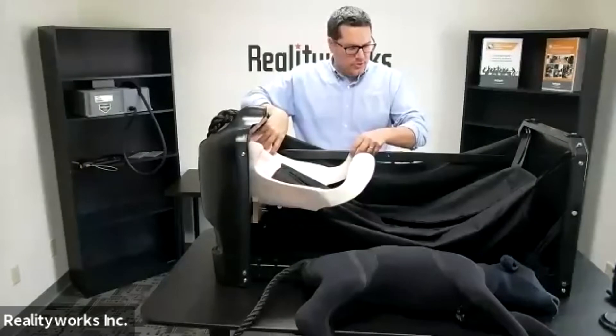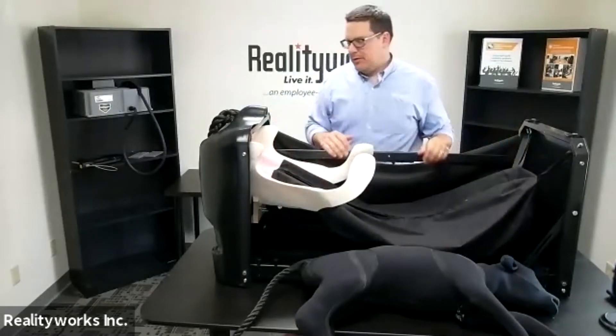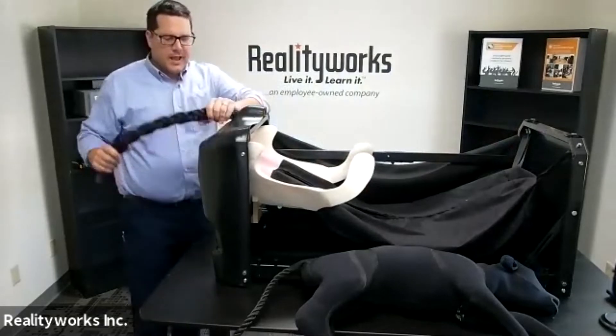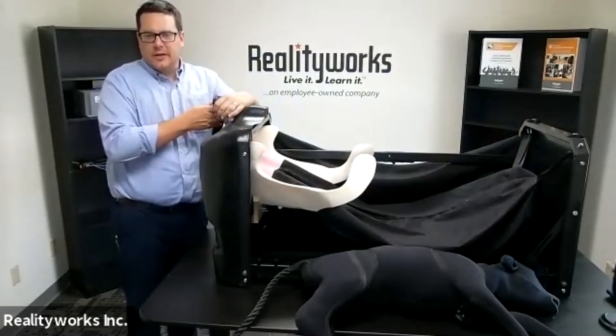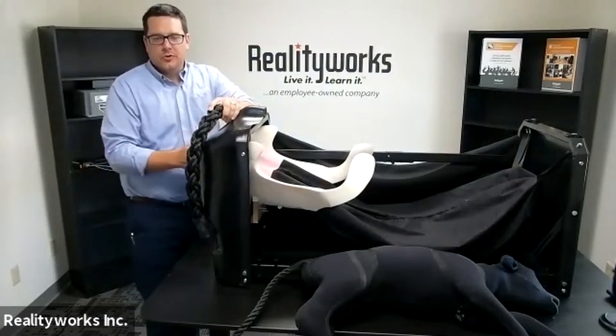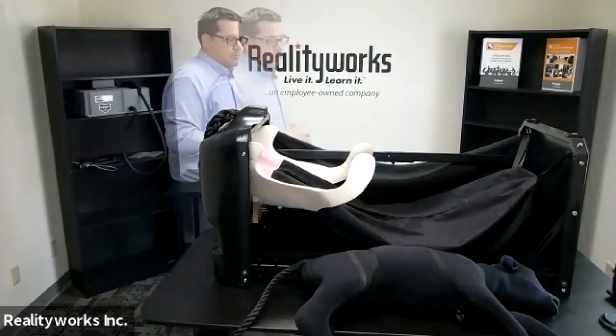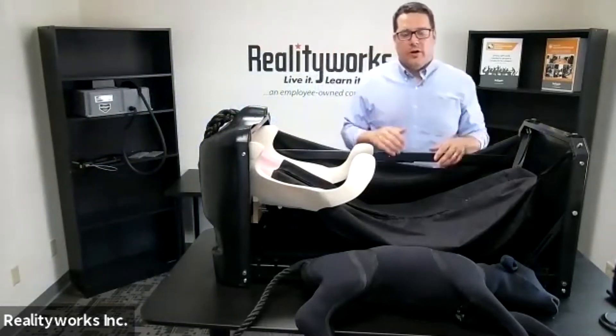Inside, we have the pelvic girdle and the opening — our bag for the animal itself. The back end has a tail, which gives you realism — you have to actually move the tail out of the way. Then we have the birth canal of the animal, so as you go through this you can actually do a real birth with our calf model.